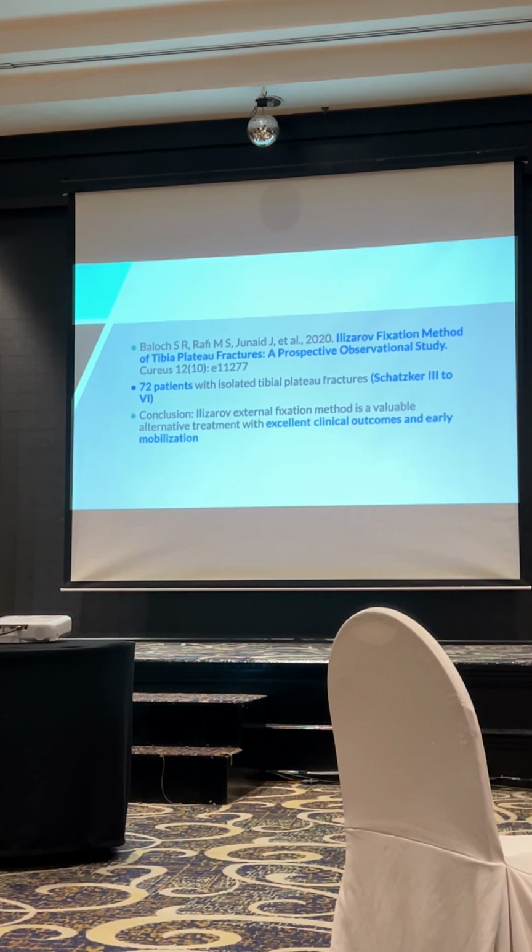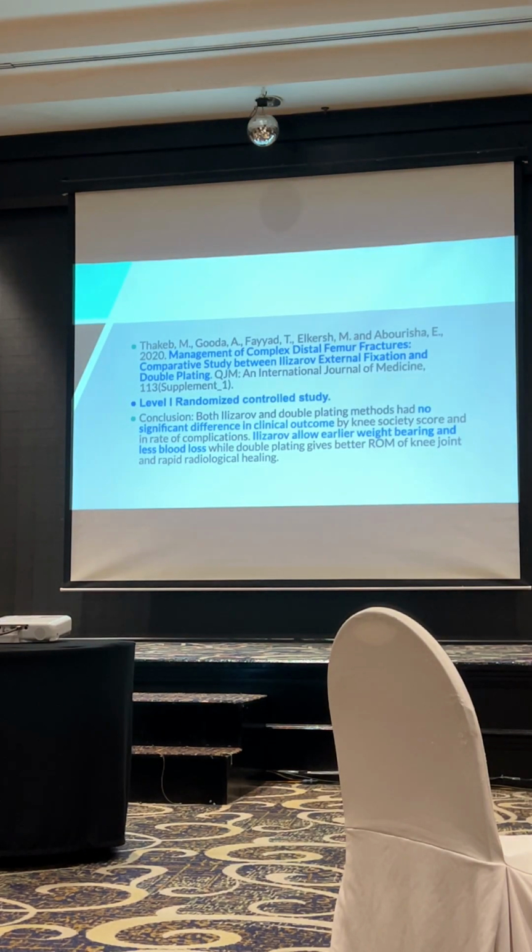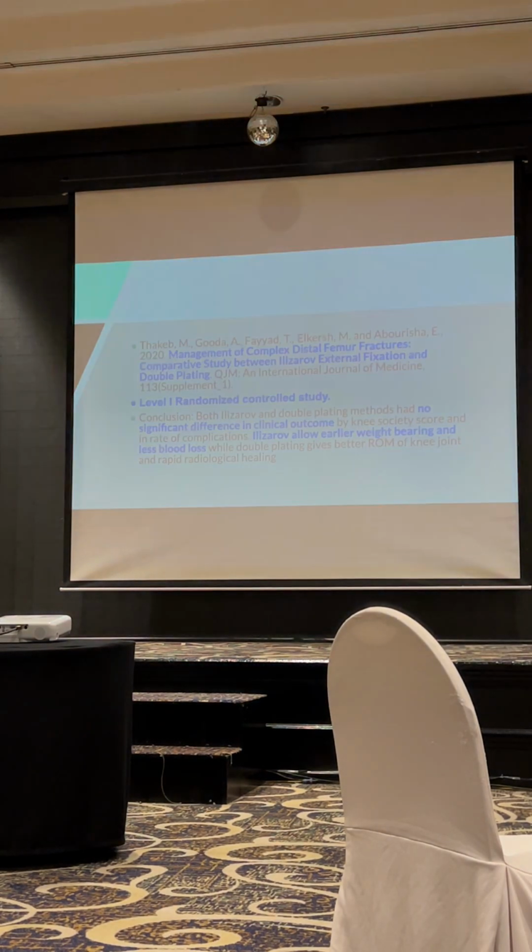So a paper from Balog 2020 says that for periarticular fractures, Ilizarov can provide excellent clinical outcome and early mobilization. And then another paper for complex distal femur compared Ilizarov and double plating. Function-wise, Ilizarov allows earlier weight bearing and less blood loss compared to double plating.